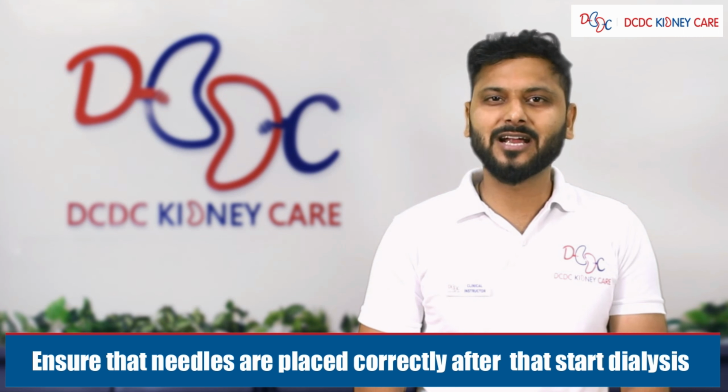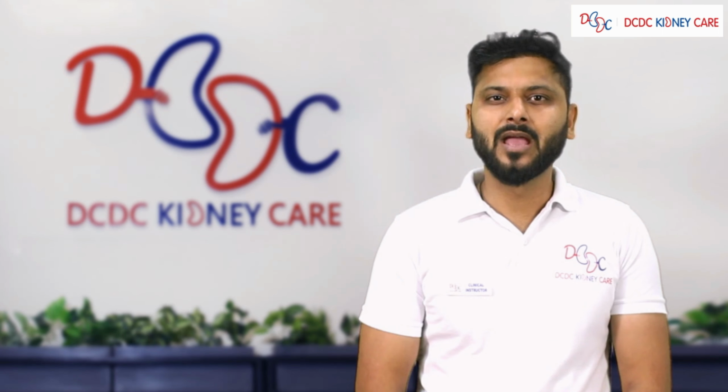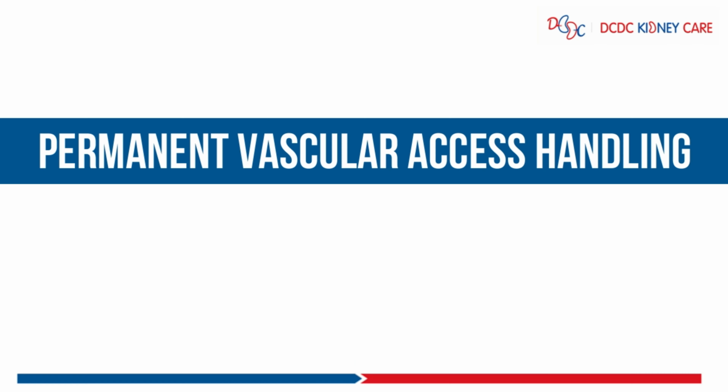After that, start dialysis. Keep blood pump speed at 120 ml per minute initially. Don't prick again and again. Don't use the fistula if infection is visible.